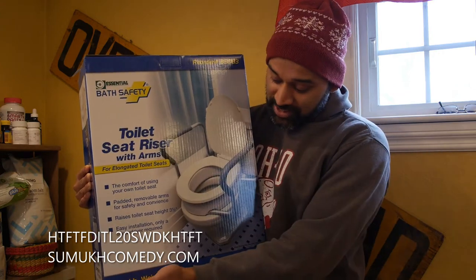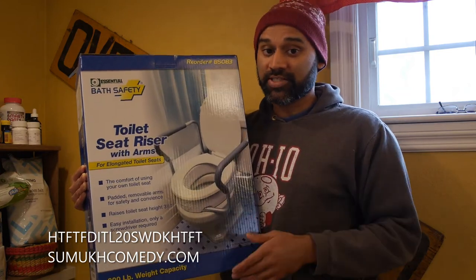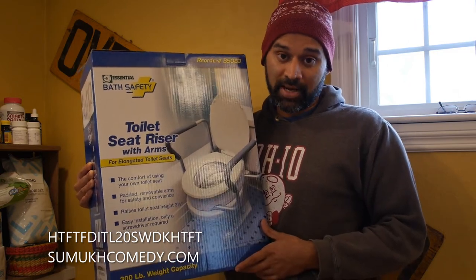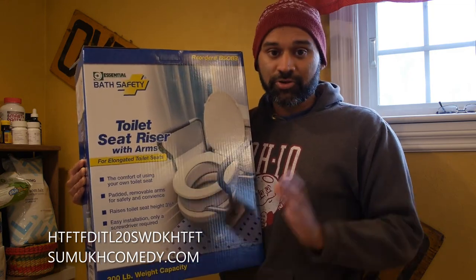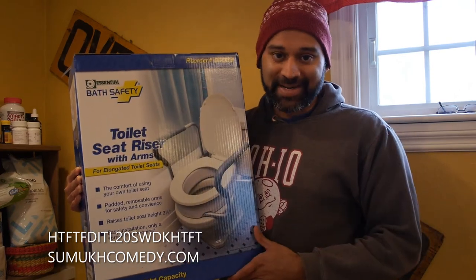It also says it is a 300 pound weight capacity. So when you do invest in a toilet seat riser, make sure to think of that when thinking of the individual you're installing it for, and if they're above 300 pounds, then find an appropriate toilet seat riser.